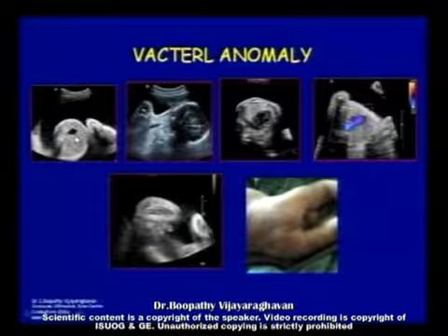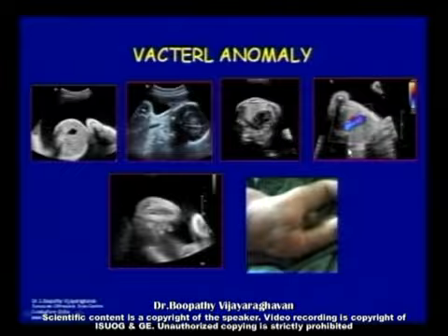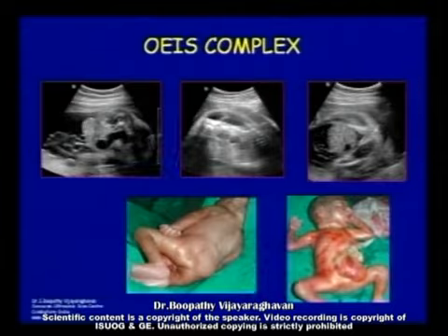Still you see the stomach, but there is a blind esophageal pouch indicating esophageal atresia with tracheoesophageal fistula, a cardiac anomaly, and non-visualized anus. So with these anomalies, additionally, when you see that the anus is not visualized, then you are diagnosing a VACTERL complex.